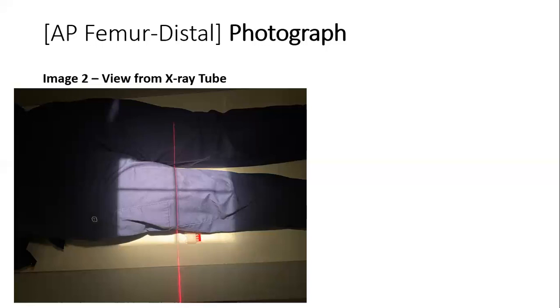Our kVp for this image should be approximately 70 to 75 kVp. We should probably go closer to 75, depending on how big the patient is.